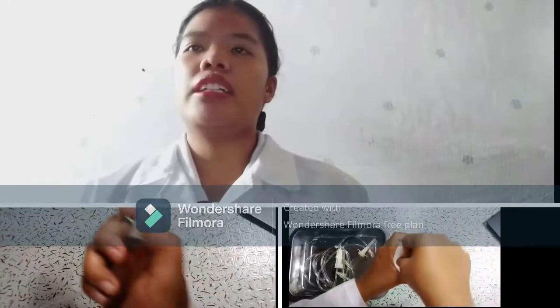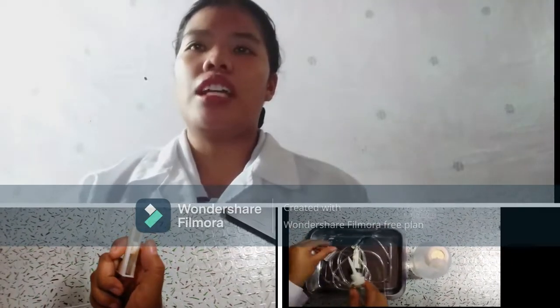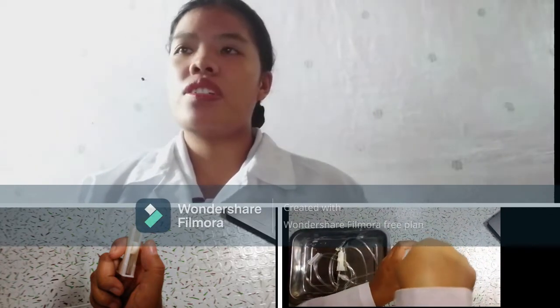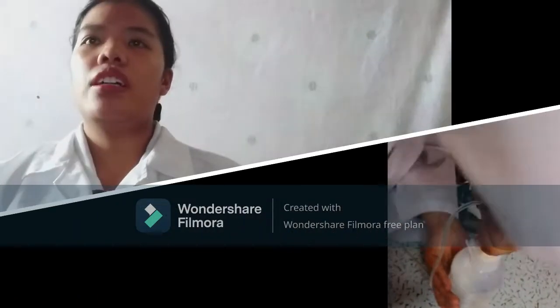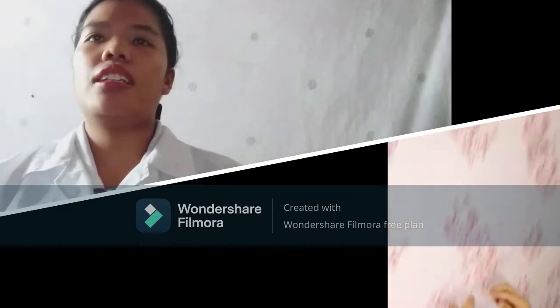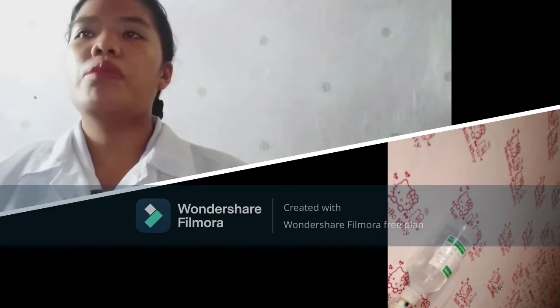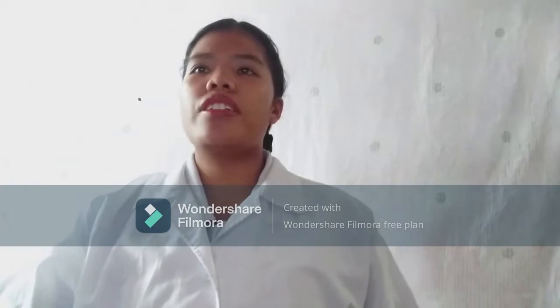Tubing: uncap the spike and insert it into the entry site on the bag or bottle as the manufacturer directs. If an additive is ordered, incorporate it before inserting the spike into the entry site. This punctures the seal in the IV bag or bottle. Suspend the IV solution on a hook in the preparation area and press the drip chamber and allow it to fill at least halfway. Suction effect causes fluid to move into the drip chamber and also prevents air from moving down the tubing.